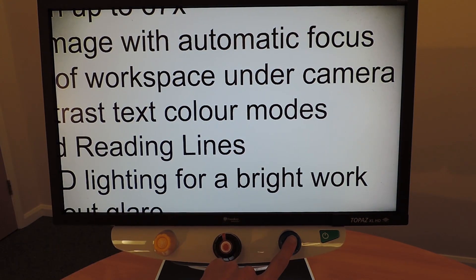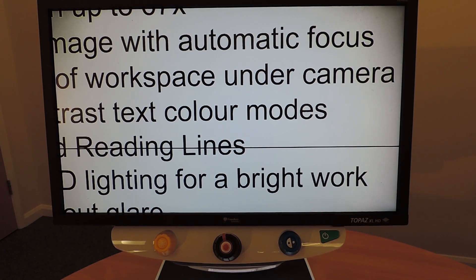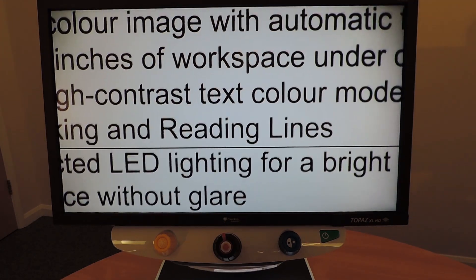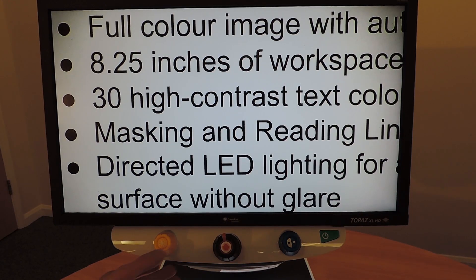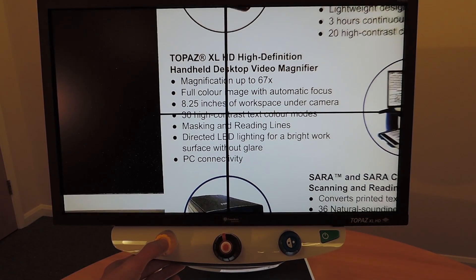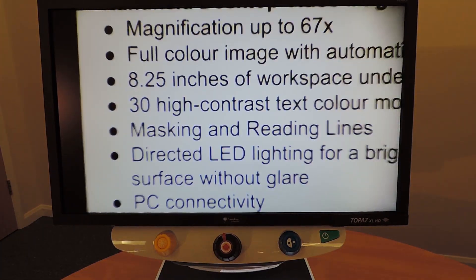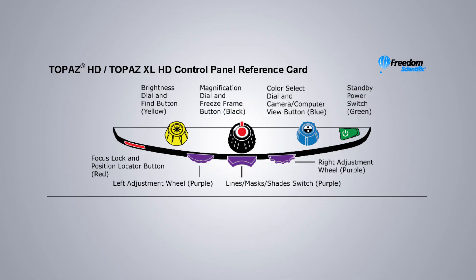By pressing the centre of the blue dial you can bring up a single horizontal line called the reading line, which displays on the screen to help you maintain your place whilst reading a document. It is useful when using the XY table to scroll your document across the screen. There's also a button in the centre of the yellow dial — press this to activate the find feature, which paves the way for easy document navigation. By pressing the centre of the magnification dial you can freeze the image anywhere on the screen so that you don't lose your place.